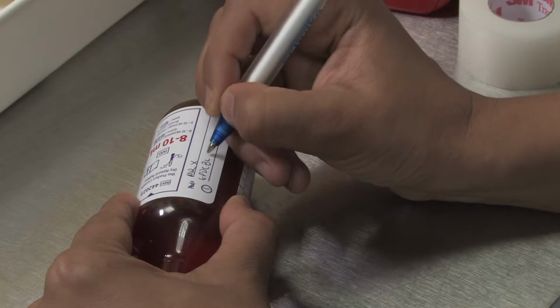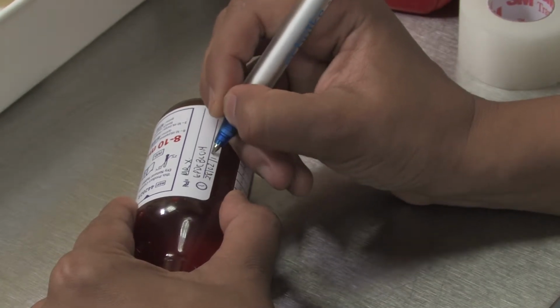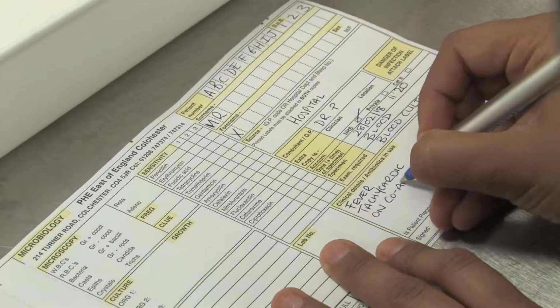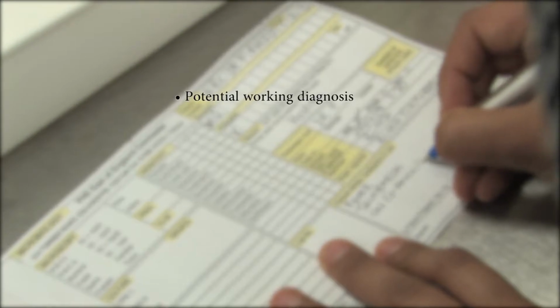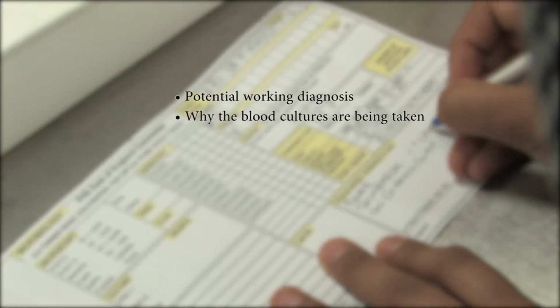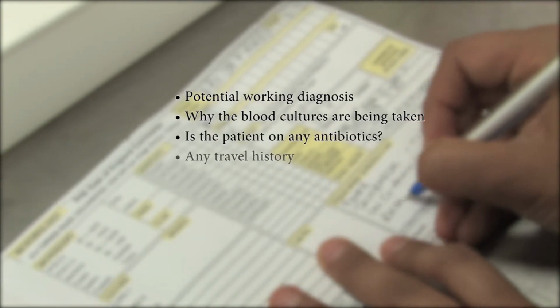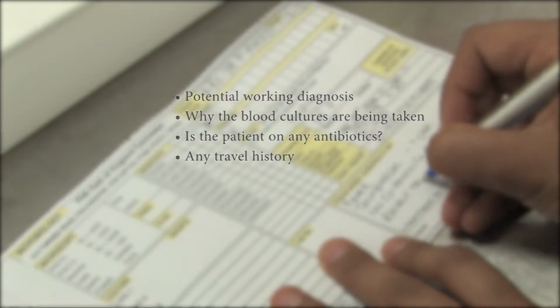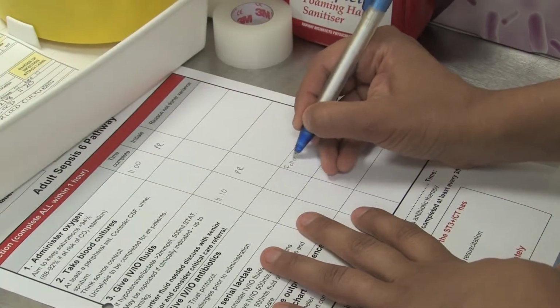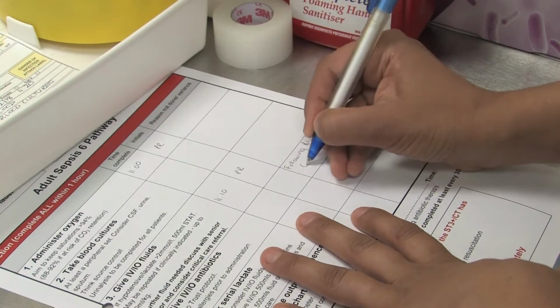Once you have taken the blood cultures, please remember to label them at the patient's bedside, not covering the barcode. Give full clinical details on the microbiology form, including any potential working diagnosis, why the blood cultures are being taken, whether the patient may be on any antibiotics, and if there's been any recent travel history. It may also be appropriate to complete a sepsis 6 bundle form, as the patient may have been admitted with or may have sepsis.